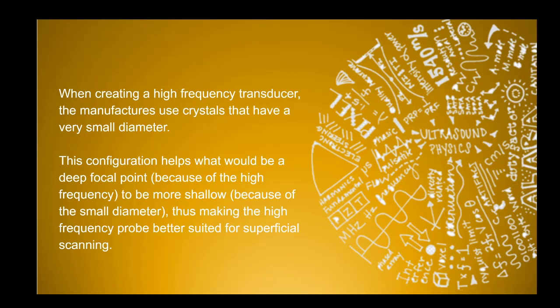So you might be thinking, after discussing all of these relationships between diameter and frequency, that hey, you've been telling us all along that high frequencies are good for shallow imaging, but now you just told me that high frequencies have deep focal depth. How does that work?